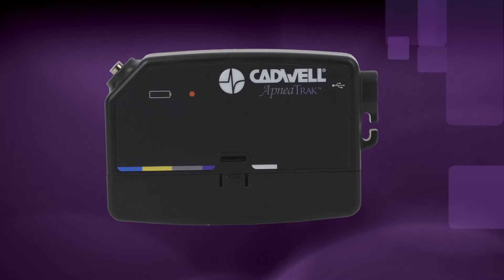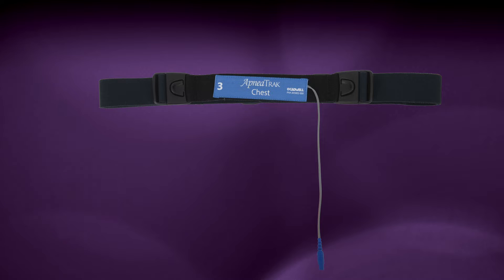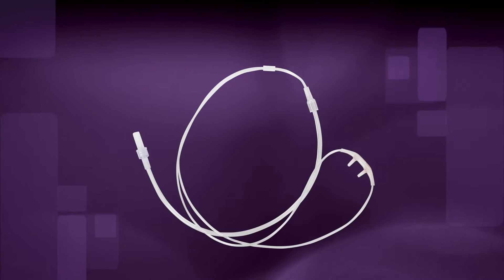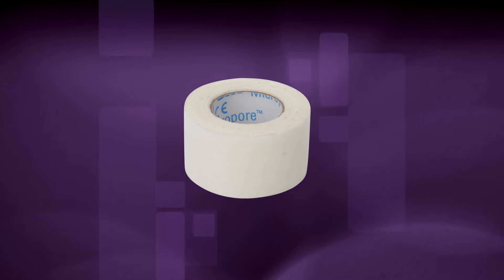Verify you have the apnea track, a chest effort belt with a blue connector, an airflow cannula with clear tubing, an oximeter finger sensor, adhesive tape, and the patient instruction manual.